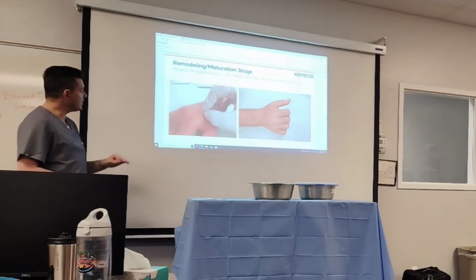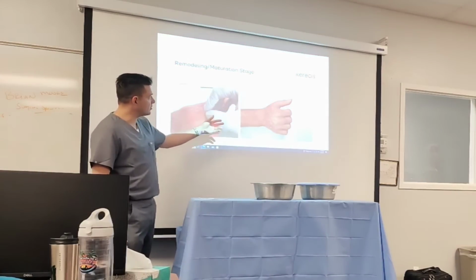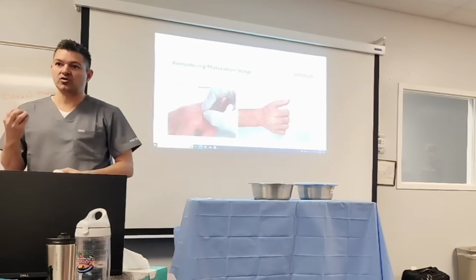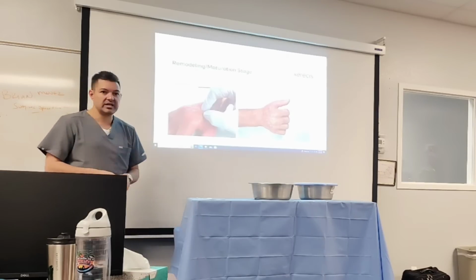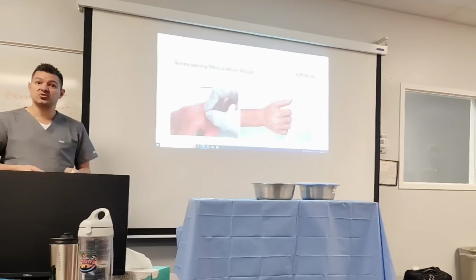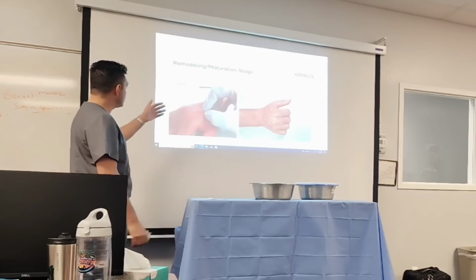So this is the remodeling that I was talking about a little bit, that provides that cosmetic and that functional piece to it through using the fish skin. I want to show you some of the slides and pictures that you can see, some of the clinical outcomes. So go ahead and slide.